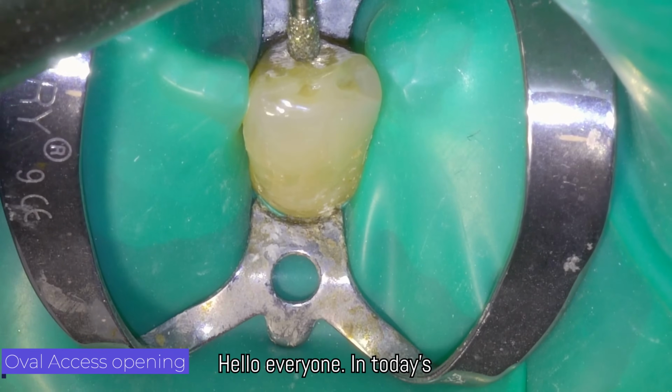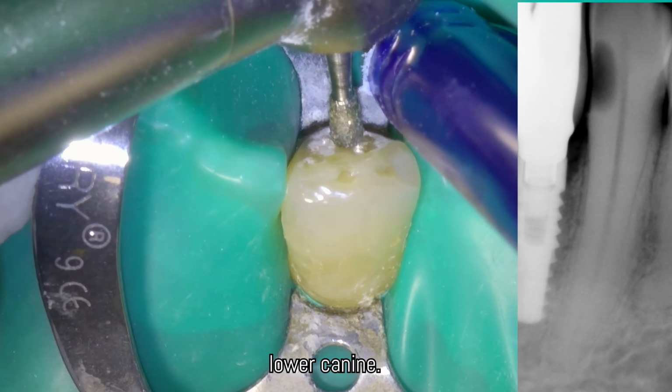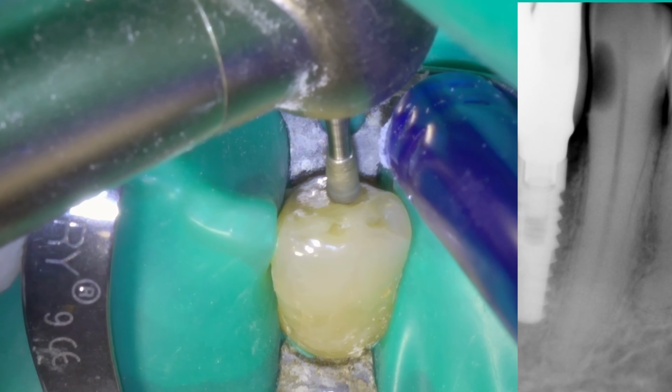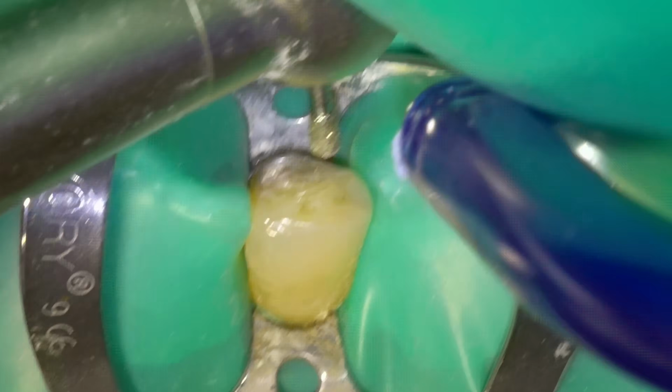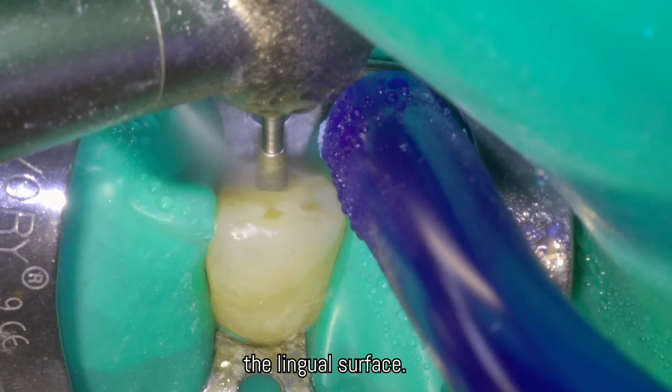Hello everyone. In today's video we make an access cavity in a lower canine. The access cavity for the lower canine will be an oval shape in the center of the lingual surface.